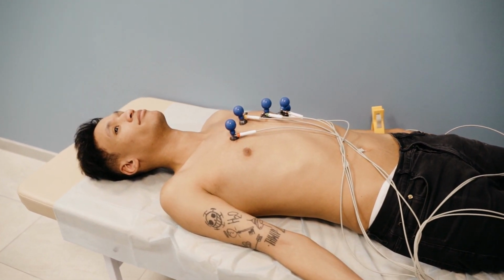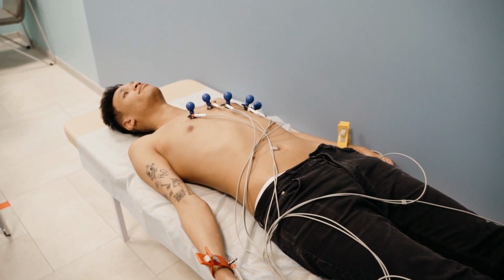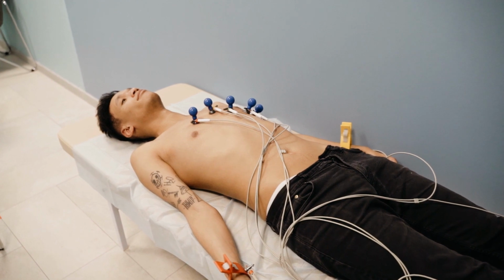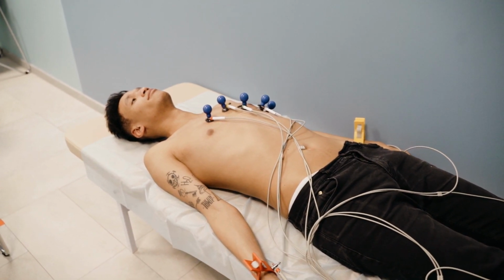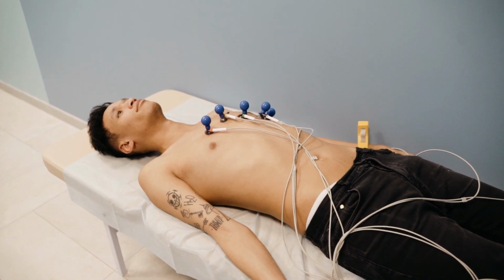If there are some problems, let's say tremor like in Parkinson's disease, other types of tremors or other types of problems, you should always observe them, and try to minimize them as much as possible, because otherwise ECG quality will be low. Something called artifacts, which I'm going to talk about later, will occur on ECG, and obviously this will make reading ECG a little bit harder, especially if you are not specialized in reading ECG in the first place. Before we start reading ECG, let's look at the ECG paper.